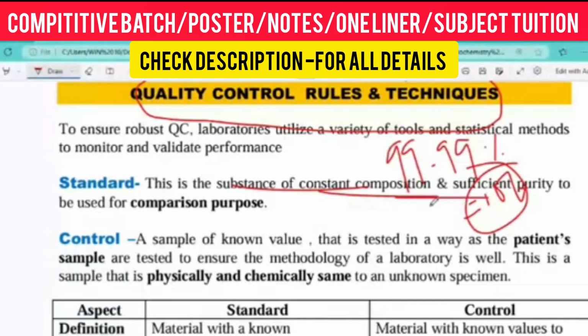Standard is used for comparison purposes, so that we can compare with the test and with the blank, so that we can get the OD, optical density. Getting my point? So that we can easily do the calculation part. Nowadays every machine is automated, so it does not require any calculation. But I will teach you how to calculate. I will teach you how the reaction is happening. I will teach you where the color development is happening. Okay. Now we are coming to the control.